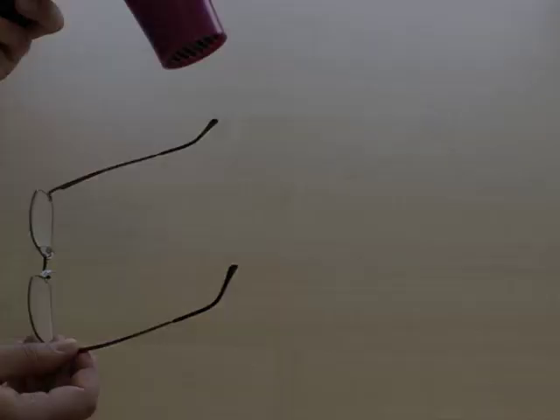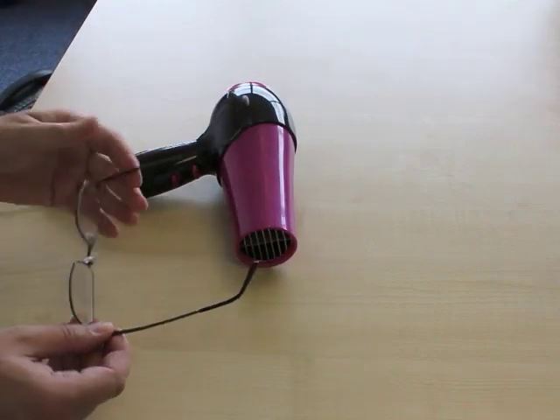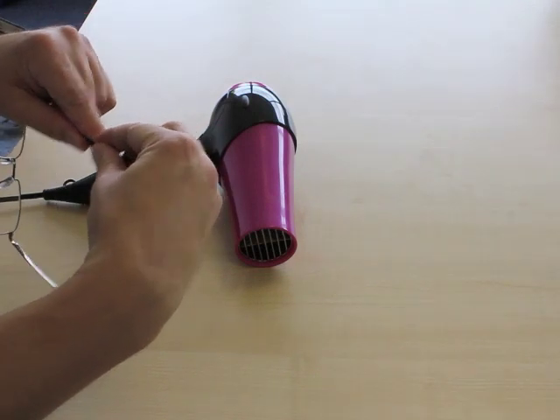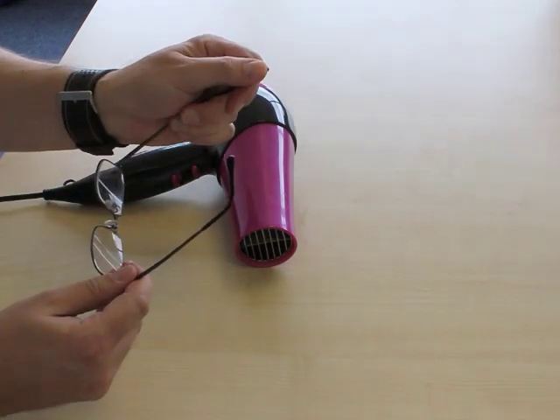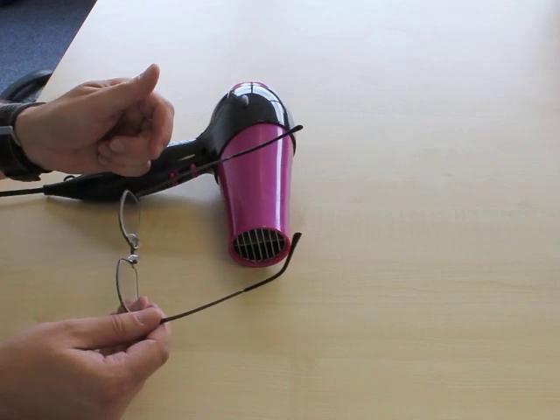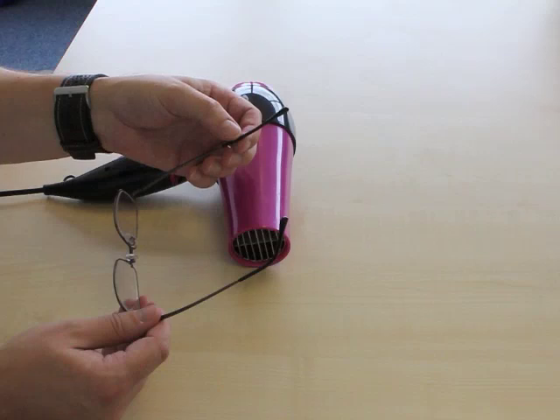Apply the heat and then make the side straight so that it's parallel. The reason you do this is because you want a nice smooth curve the next time you adjust it. Now take note of where you want to adjust the side — you can mark it with a pen or something.